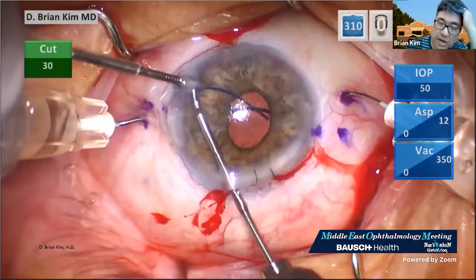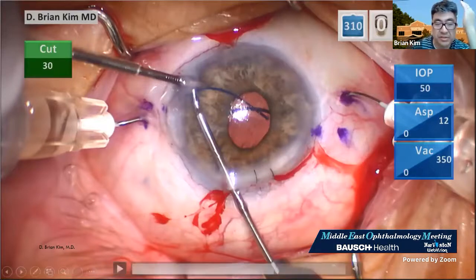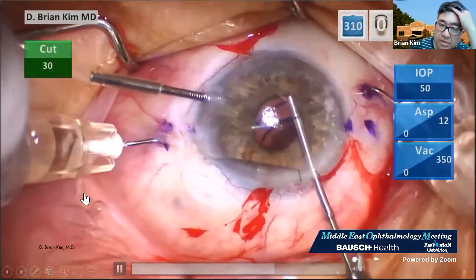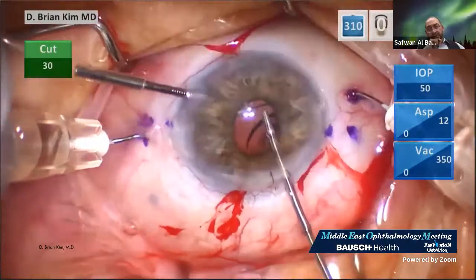Yes. Right. Well, right now, I'm not applying too much tension, and you saw with this simulated eye, you're right. There are more risk factors, definitely, when you try to use excessive force on those PMMA haptics. I agree. Oh, great. Yes, see the bubble is toward the haptics.